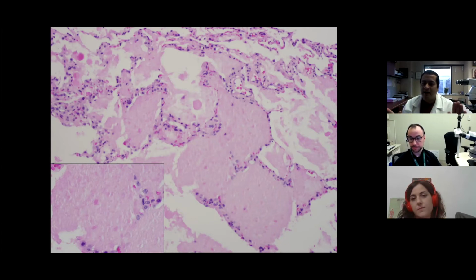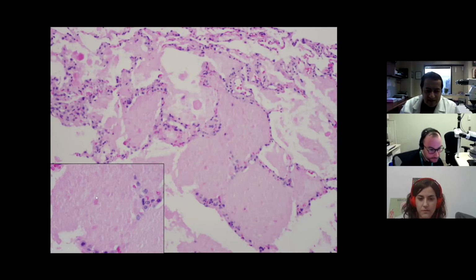So for edema, it looks very, very similar to this, except this is more of a granular appearance, which you see on the H&E. I love this as a histological clue, these big chunks of pink material, which are actually bits of surfactant. These big chunks of pink material are very important to tell apart from edema, which looks all the same throughout. It's all pink.